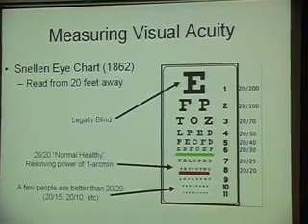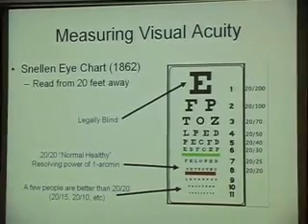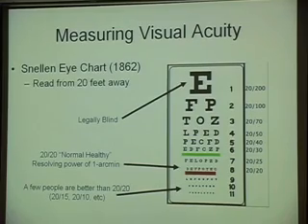How well do you see? We measure that with this chart. Everybody's familiar with that chart. It's 150 years old, which is pretty amazing.